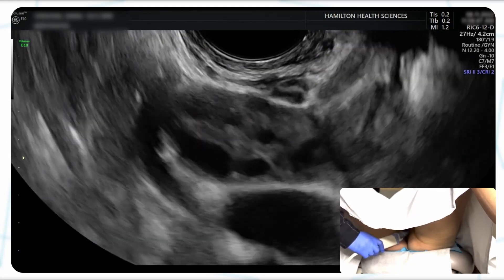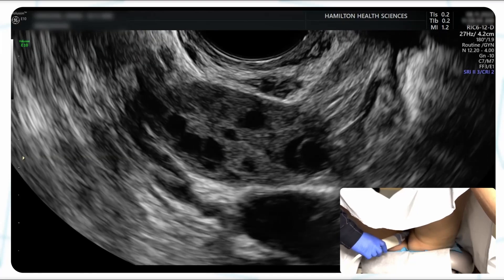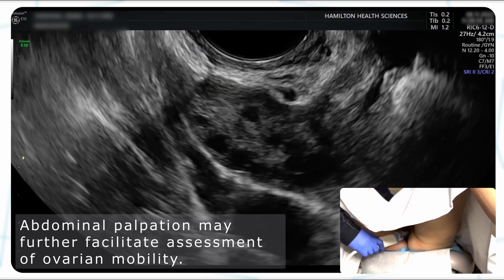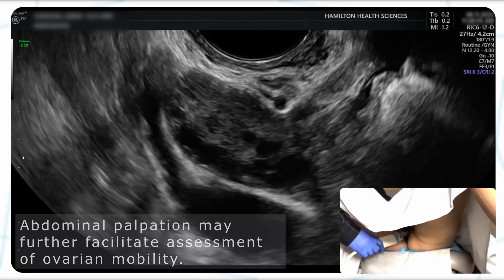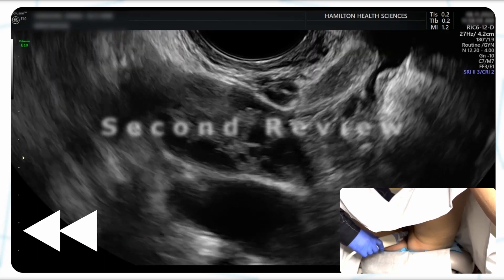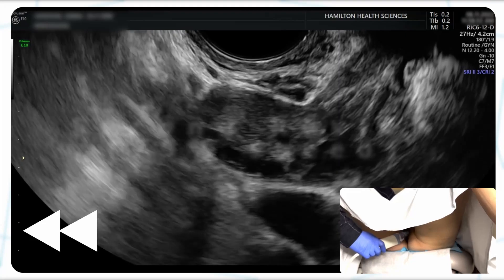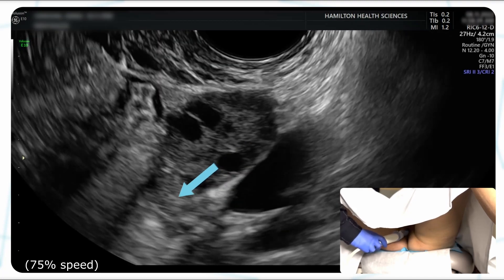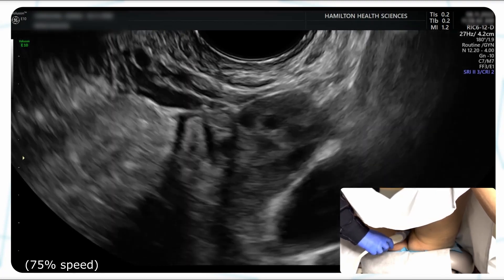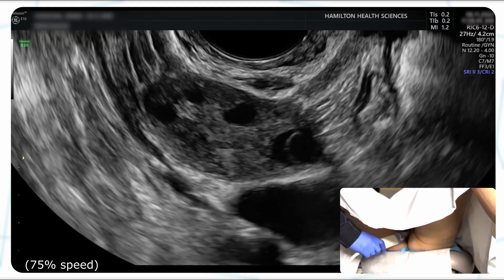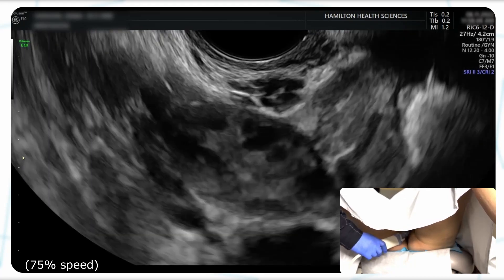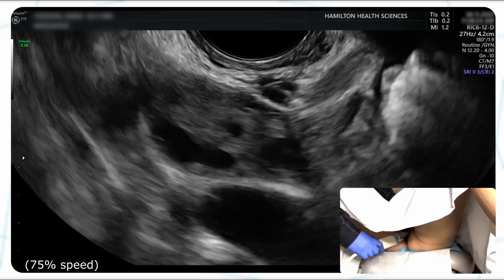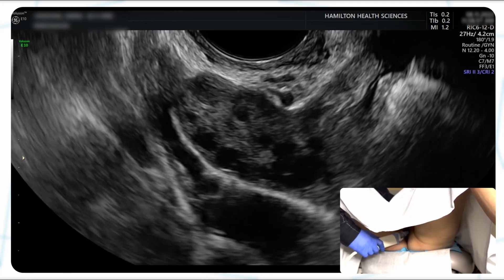Going to sagittal and applying pressure, we again see superior and inferior mobility. We can also amplify that by placing the hand on the abdominal wall and pushing the ovary. For the recap: pressure is applied with the transvaginal probe to the ovary in a transverse view, with lateral mobility highlighted by the contrast of the neighboring iliac vein. Switching to a sagittal view, we assess for inferior and superior mobility. The sonologist then applies abdominal palpation, which manually displaces the ovary while surrounding tissue remains stationary.